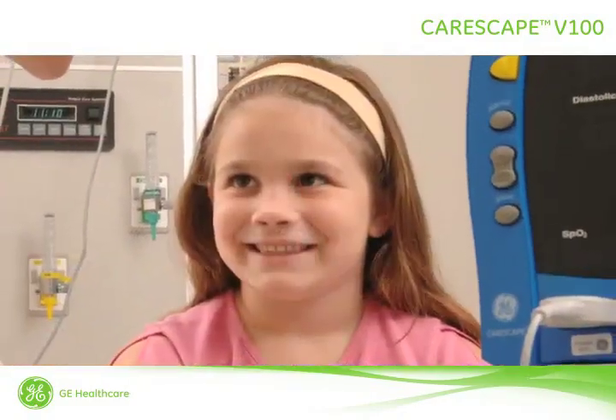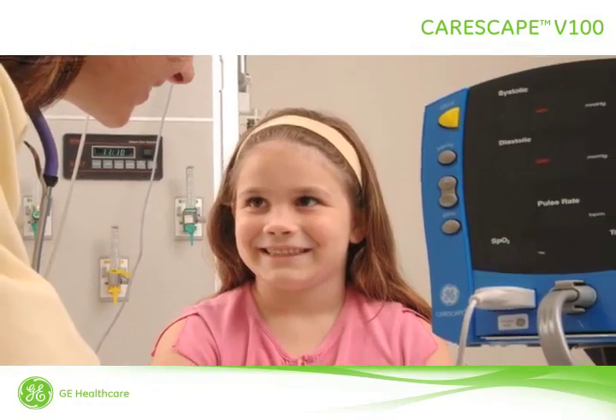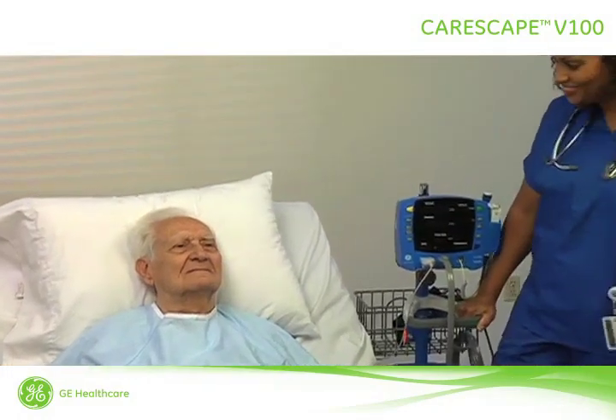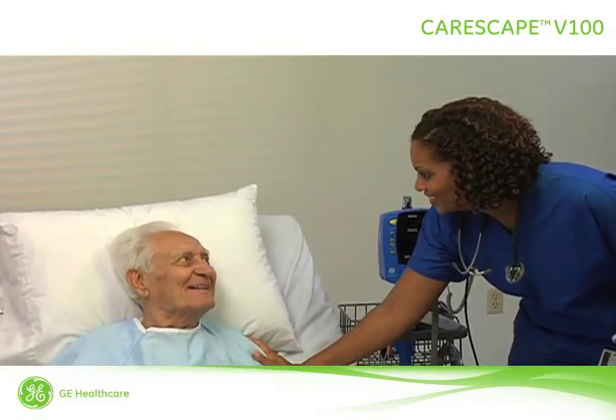The Carescape V100 Vital Signs Monitor provides a small, portable, easy-to-use monitoring alternative for subacute hospital and non-hospital settings. You can use the V100 on adult, pediatric, or neonatal patients to gather current clinical intelligence to help you make fast, quality care decisions.